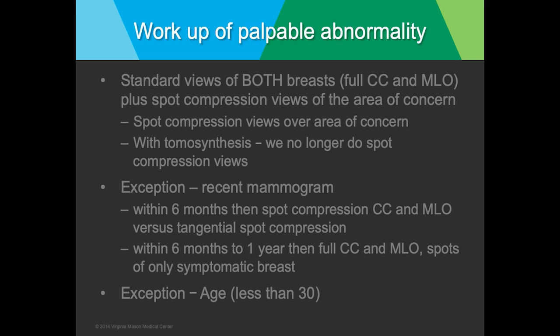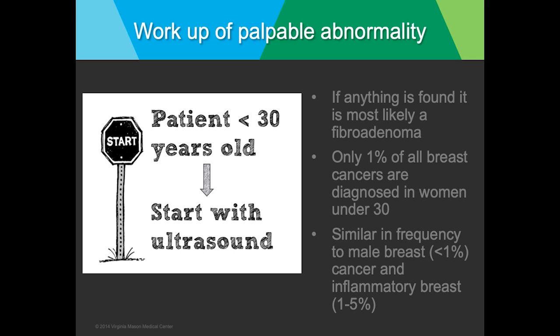If the patient has had a mammogram within 6 months to a year, then we do a full CC and MLO view of only the symptomatic breast. Another exception is age. If the patient is less than 30, we start with ultrasound.